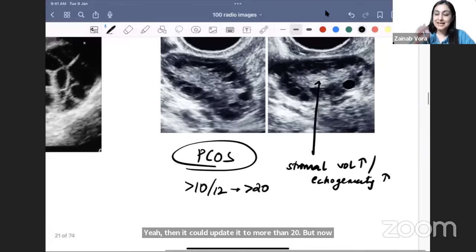At 6.5 to 7 weeks, the fetal pole develops and the fetal heart rate can be seen, because the cardiovascular system is the first organ system to develop. Never do Doppler in the first trimester — use M-mode ultrasound to document fetal heart rate, as M-mode stands for motion.